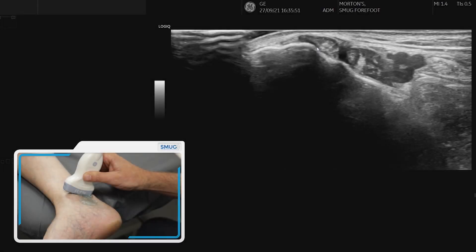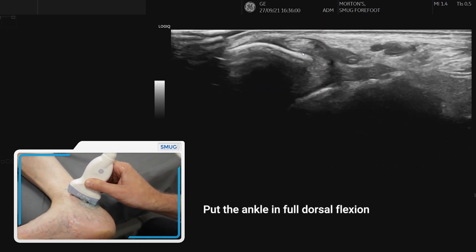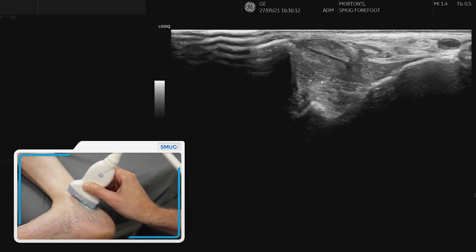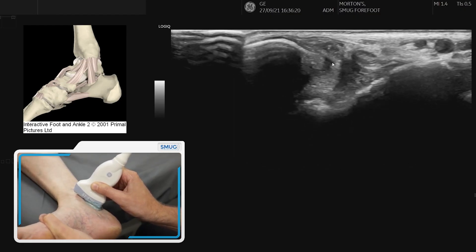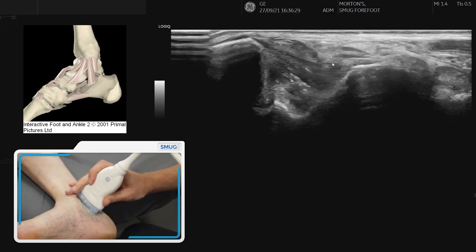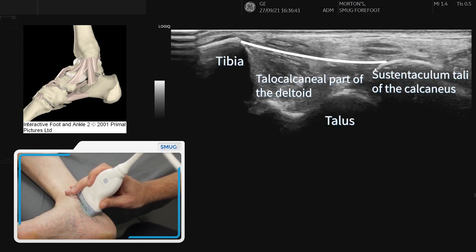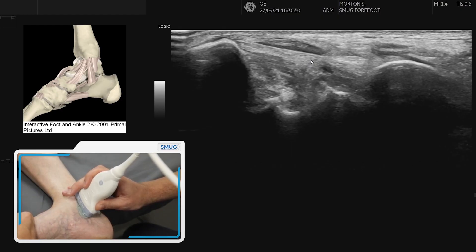To assess the deltoid ligament we first find tibialis posterior at the back of the medial malleolus. As we come around and push the foot into full dorsiflexion, as tibialis posterior comes off the bone, look underneath and you can see a very thick capsular band — that's the tibiotalar or deep posterior element of the deltoid ligament. You can stretch it with dorsiflexion and relax it. The middle band goes from the tibia onto the calcaneum — fishtailing through, you can see the fibrillar pattern from the medial malleolus attaching onto the sustentaculum tali of the calcaneum, with the subtalar joint visible below.